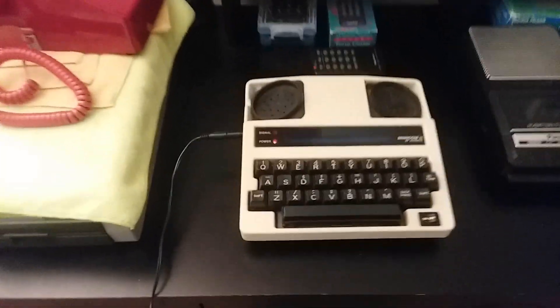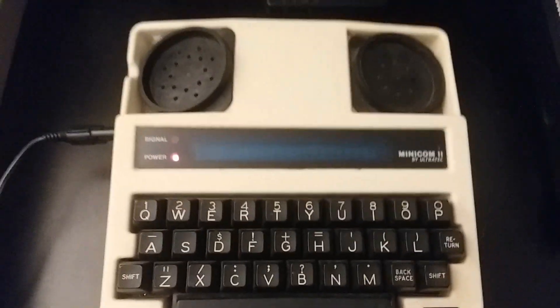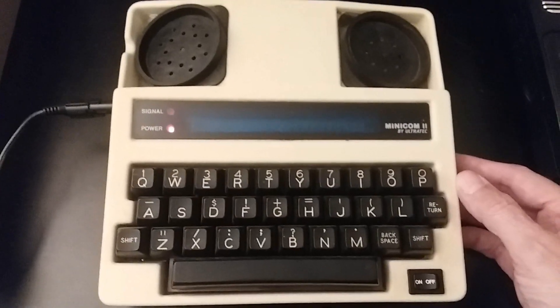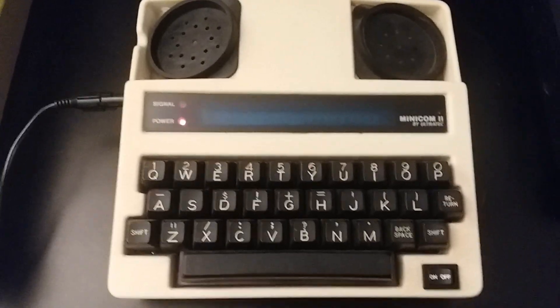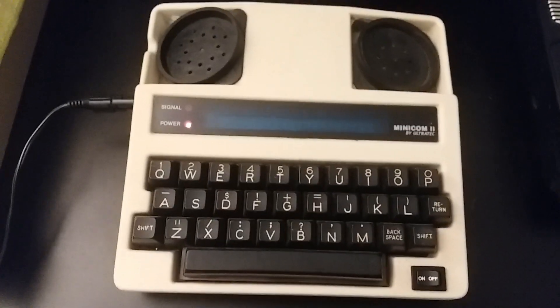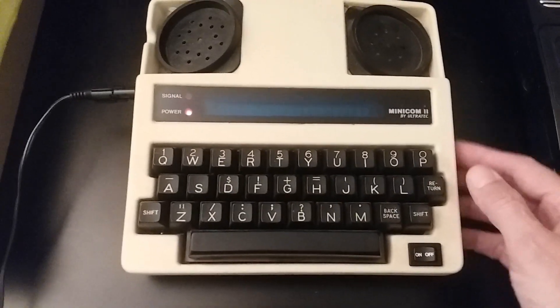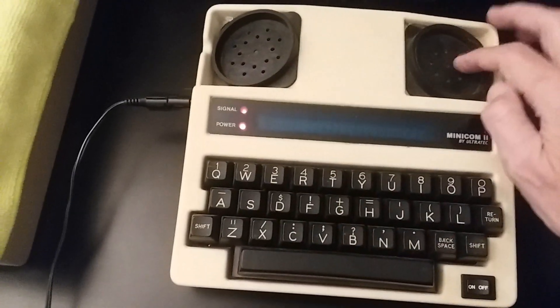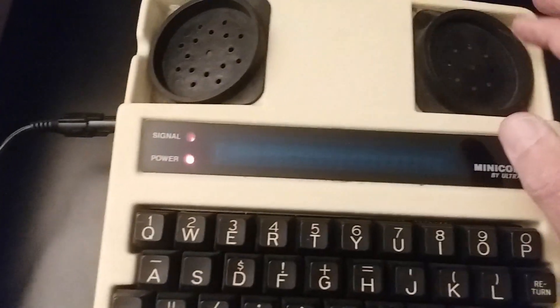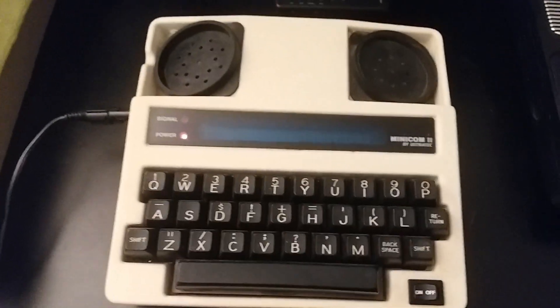What we have here is from the mailbag, came from eBay, and it is an Ultratech Minicom 2. This is a TTY/TDD machine used by people who are hearing impaired or deaf to communicate over standard landline telephones. Using these little acoustic couplers up here — you can actually see a little light blinking when I tip into it — it can hear the signal that's going to be coming over the telephone line.